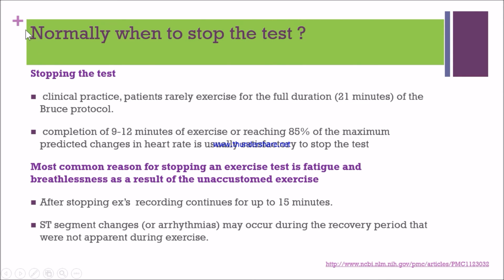As we are physiotherapists, we need to know when we should stop the test. So first of all, when to stop the test? Let's see.